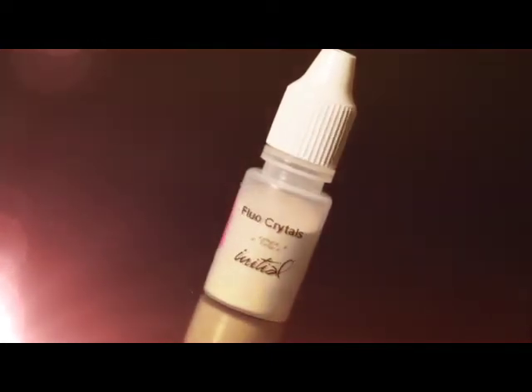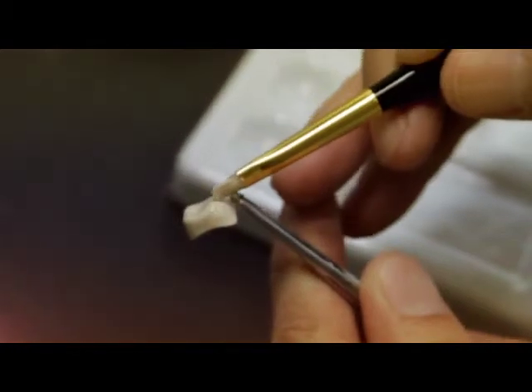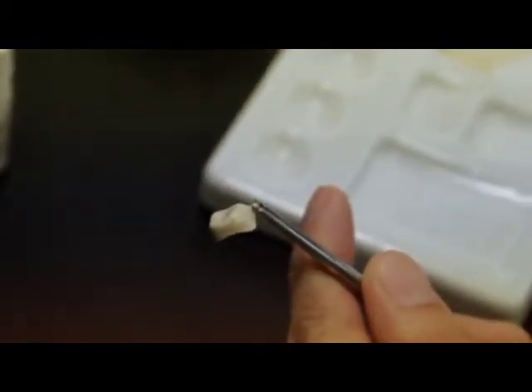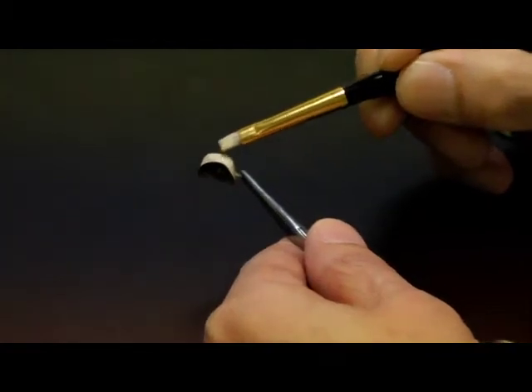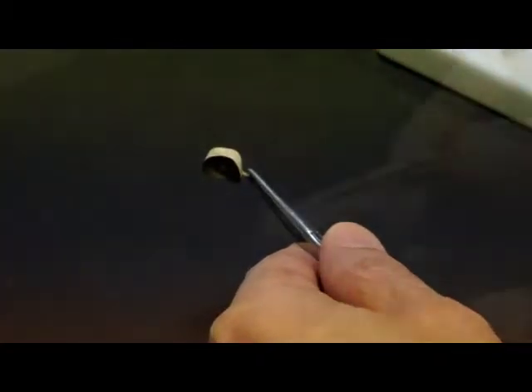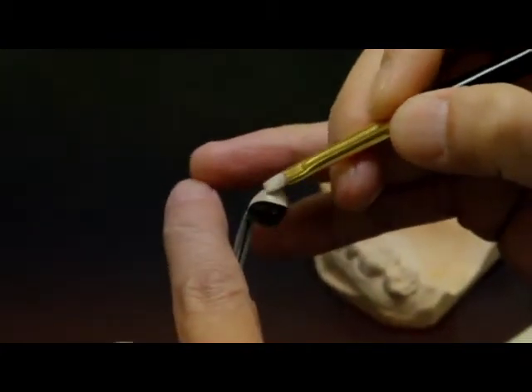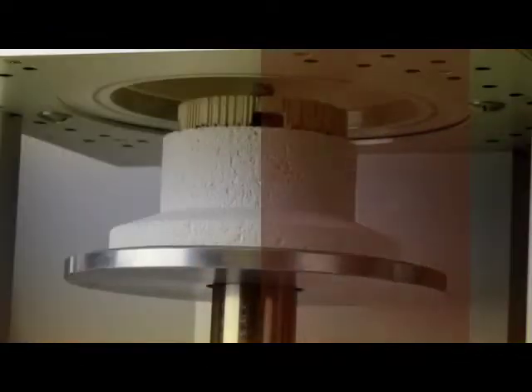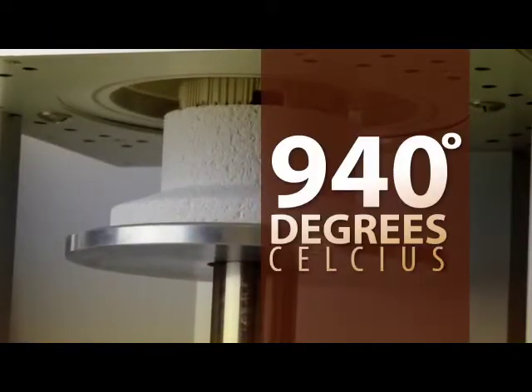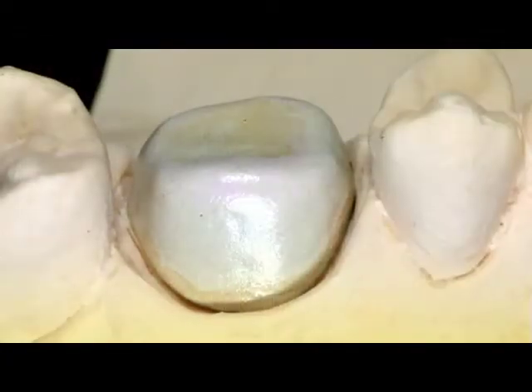Before firing, fluorescent crystals are applied on the opaque surface. After the first coat of opaque and fluorescent crystals are fired, a second layer of opaque is applied in the usual manner. The opaque should be brushed on evenly, just filling in the fluorescent crystals. Make sure that the opaque is applied thin and even. Both the wash firing and the second firing should be fired at 940 degrees Celsius and the appearance should be shiny.